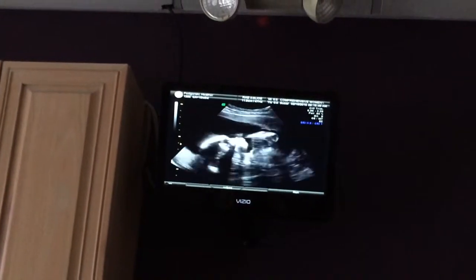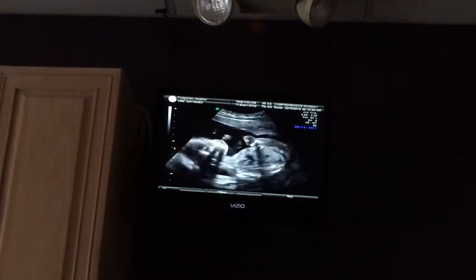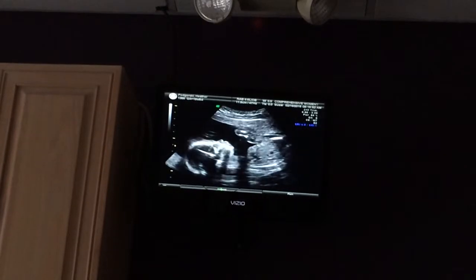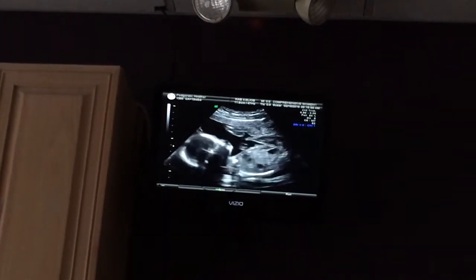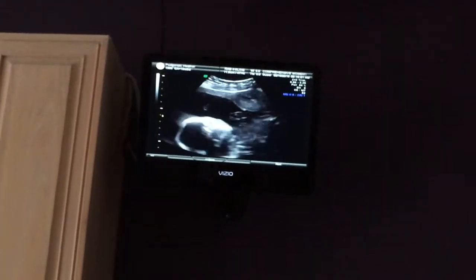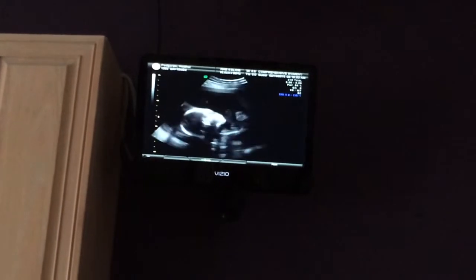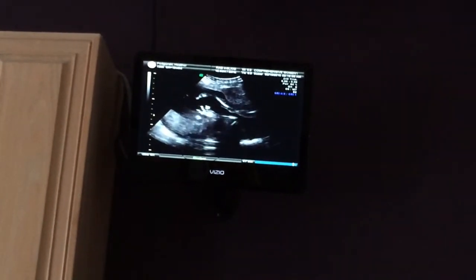Is it sucking its thumb? The hand's just out in front of the face there. It's going this way — it's slowly moving. The baby's moving, sorry. You can see the little fingers and the foot there.